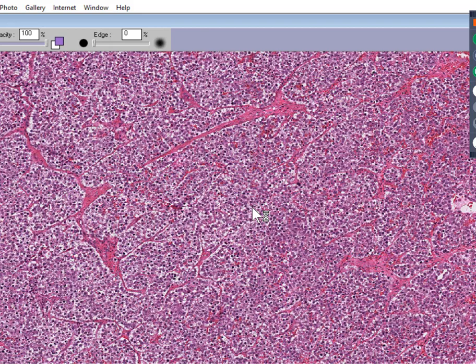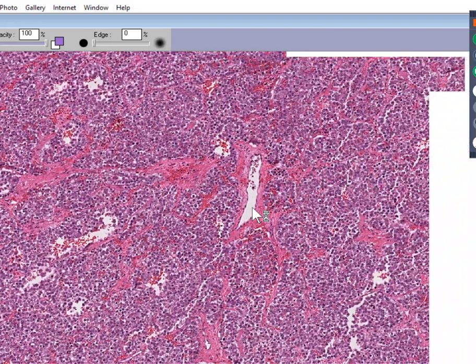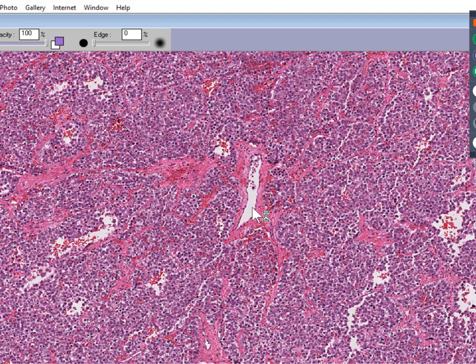Most of the tumors of the testicle are from the cells that are indigenous to the testicle, which are the germ cells. So most of the tumors of the testicle are germ cell tumors. And there's 3 or 4 major types, but this is probably the most common type of testicular malignancy. It happens to be called a seminoma. And you're just going to have to take that on faith. But the one thing that you don't have to take on faith is to look at these cells.